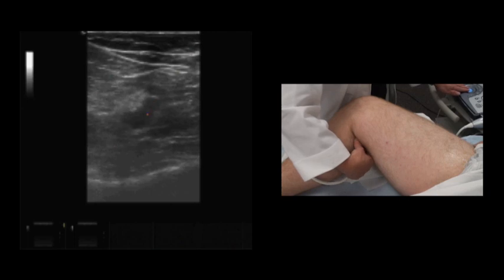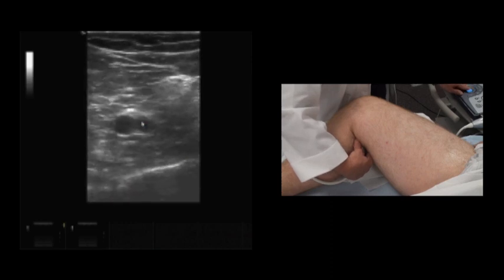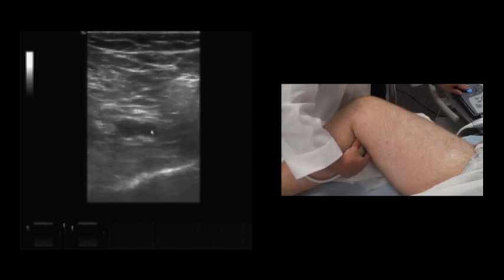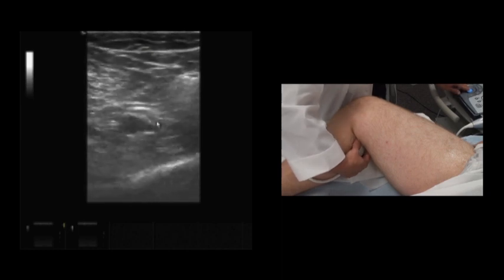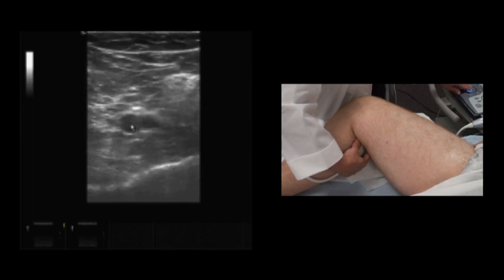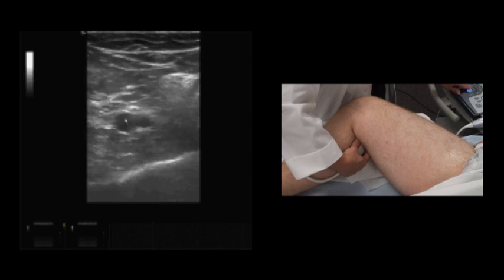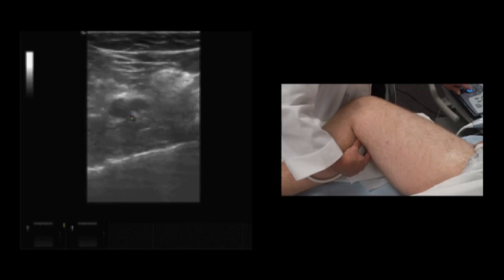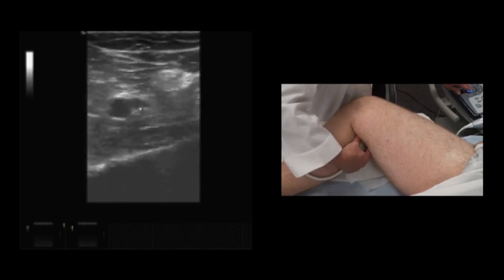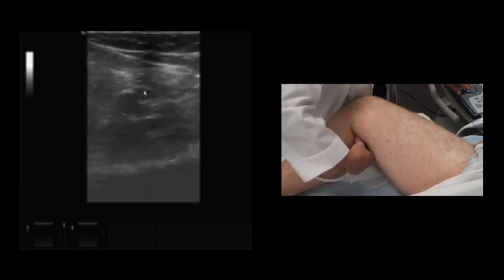I'm at the level of the popliteal vein and the popliteal artery. Note that the popliteal vein is superficial to the popliteal artery. As we scan superiorly in the posterior aspect of the thigh, note that they actually are side by side. The superficial femoral vein is medial, and the superficial femoral artery is more lateral. As we scan, we want to completely compress, making sure that it does completely collapse as the walls meet.